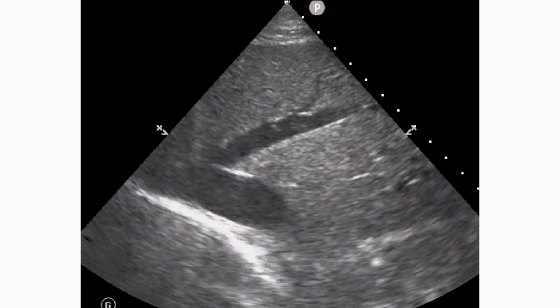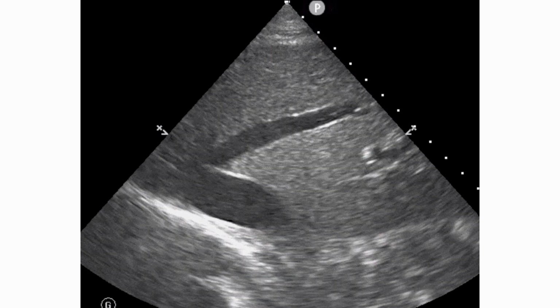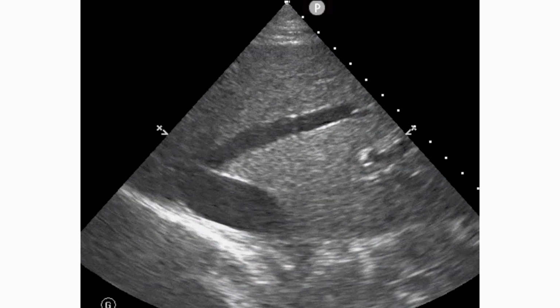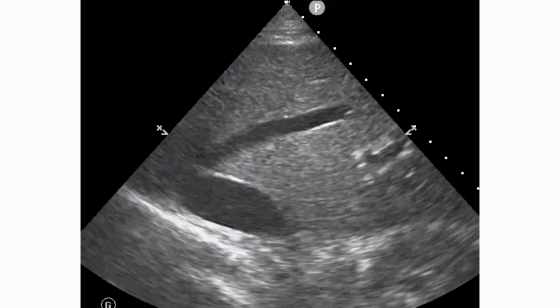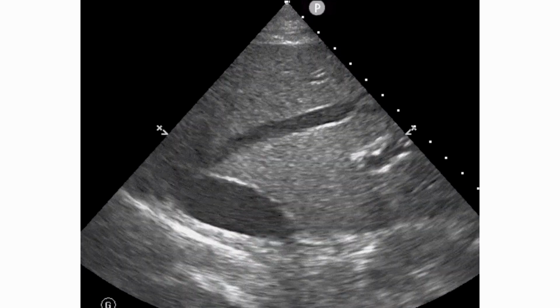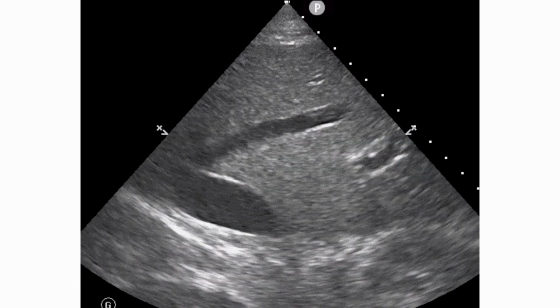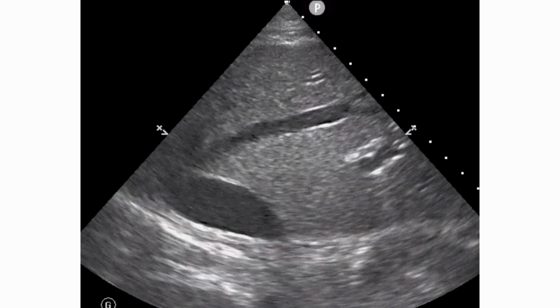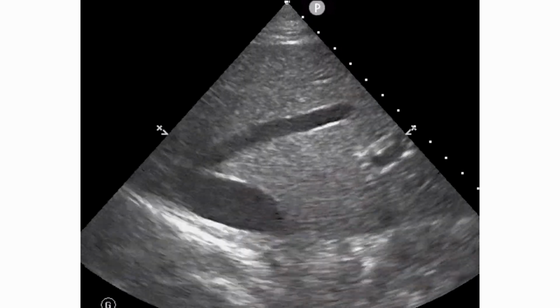As I mentioned before, getting into the numbers and details becomes very advanced and depends a lot on different patient factors, whether they're sitting up or laying down, whether they're intubated or not. So I wouldn't worry about that too much. What I do at the bedside is, does this thing look big or does it look flat? If it looks big, is it collapsing with respiration? Because as people breathe, we expect it to have some variation.